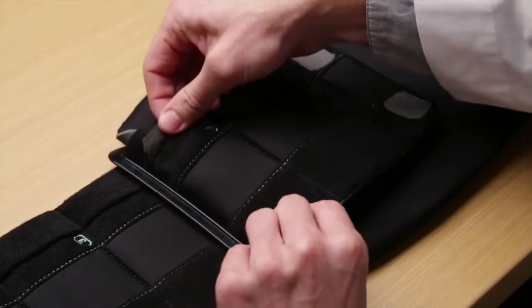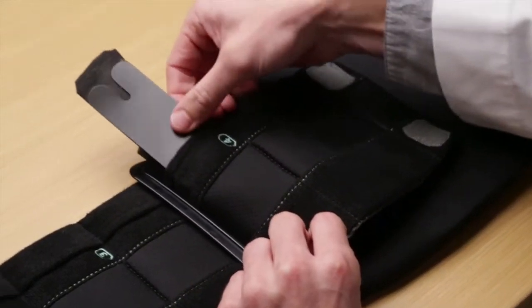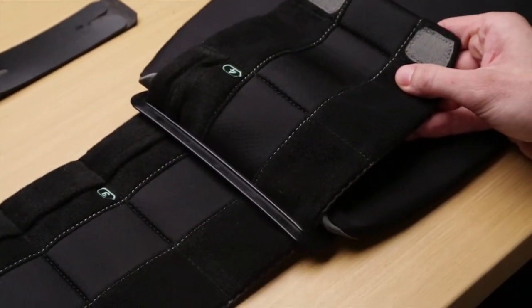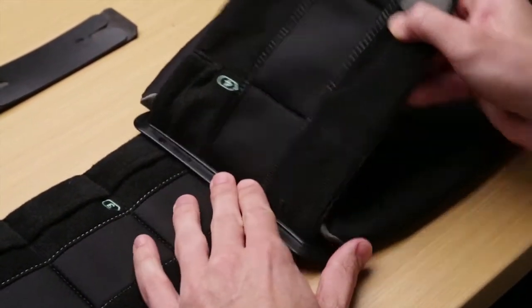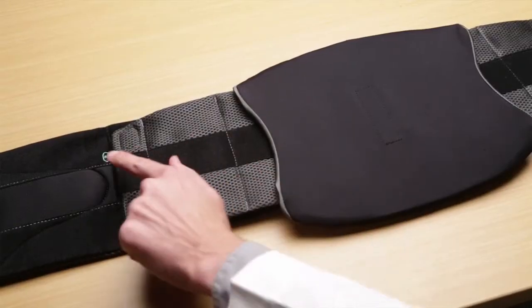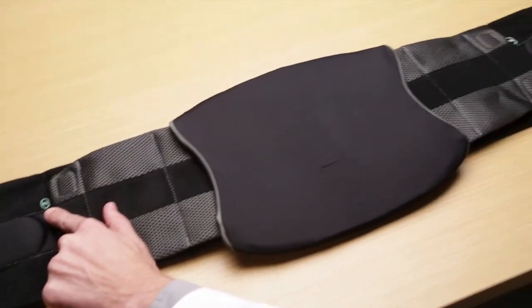The lateral stays that have been pulled through the sizing mechanism should be removed to provide the best possible fit. Once the stays are removed, press the end of the belt down to secure. Adjust both sides of the brace equally.